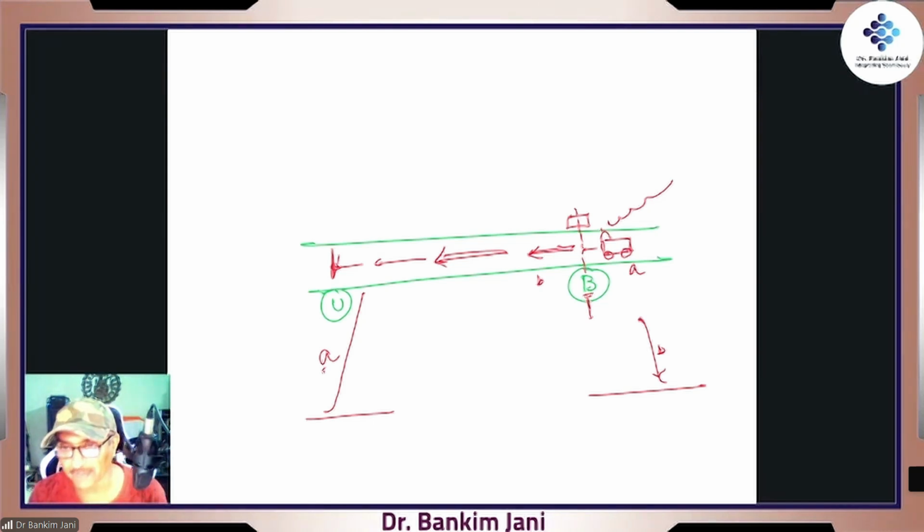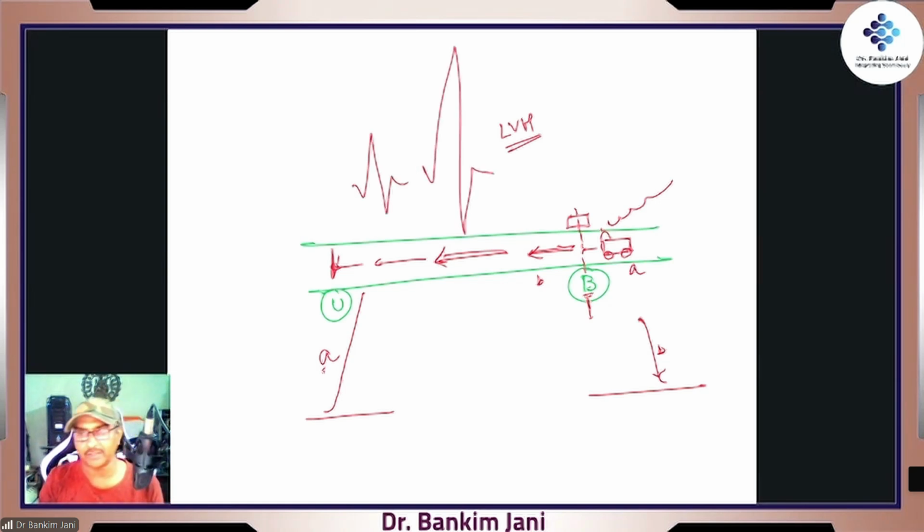Definitely, the amount of muscle affects signals, definitely. That's what we said, that when we watch left ventricular hypertrophy, you will find that compared to the normal QRS complex, the QRS complex will skyrocket. They'll be so big that they will be overlapping. Because this is the question you asked: the amount of muscle affects signals 100%. It is the amount of muscle only which we want to evaluate.